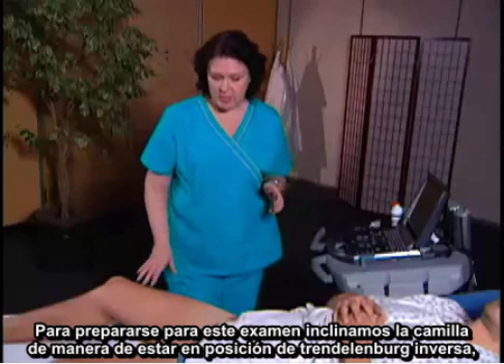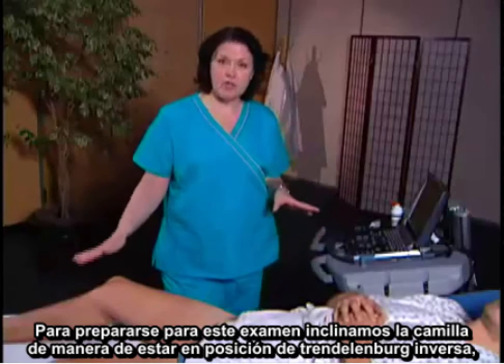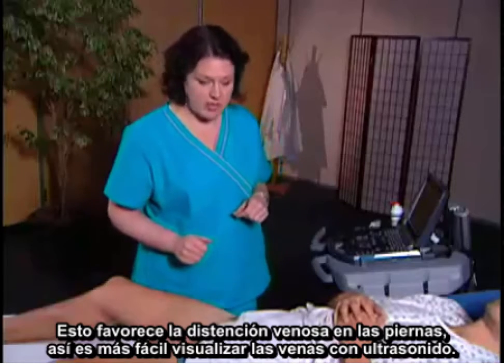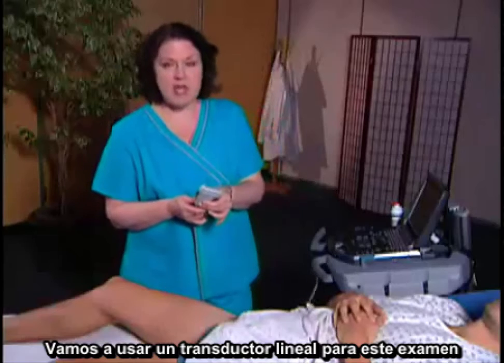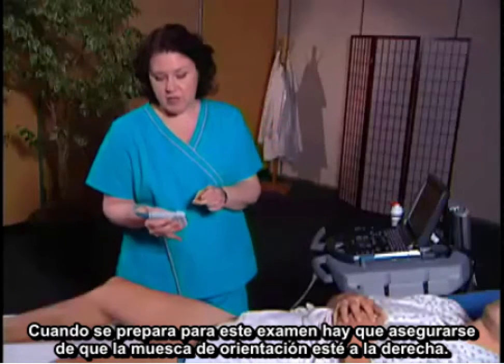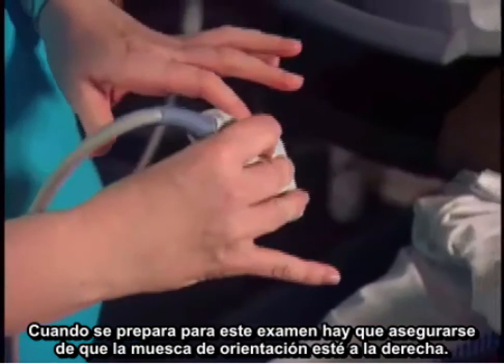To set up for this examination, you want to tilt the gurney so that you're in a reverse Trendelenburg. This encourages venous distension in the leg, so it's easier to visualize the veins with ultrasound. We're going to use a linear transducer for this examination, and the views that we do for this exam will just be in a transverse orientation only. So when you're setting up for this examination, make sure the orientation marker again is to the right.